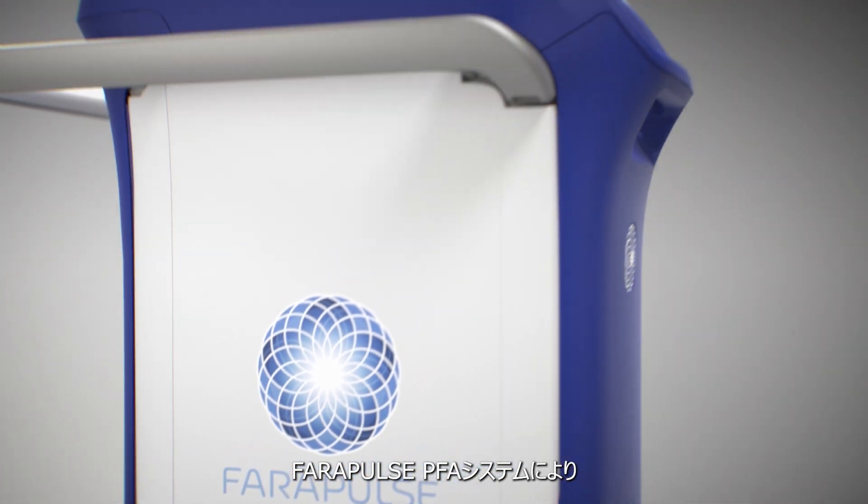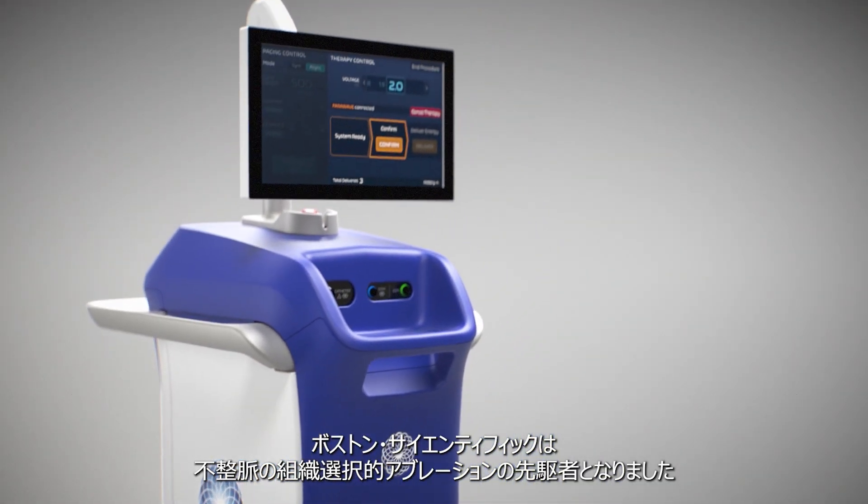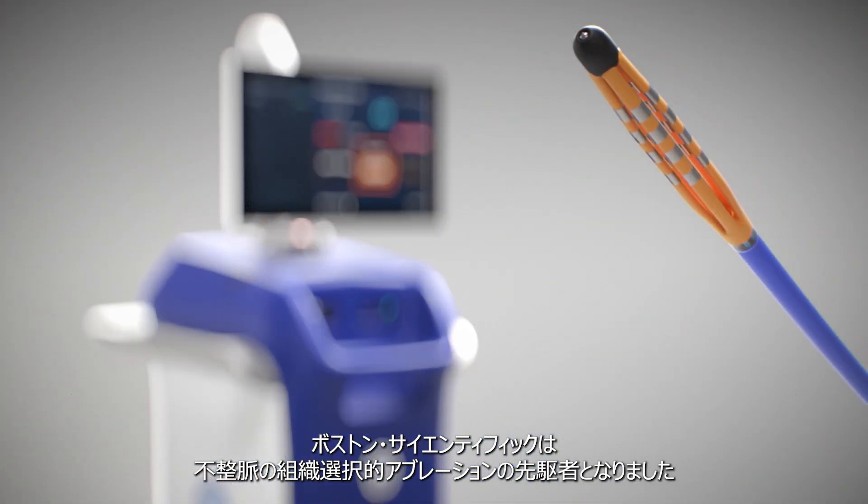With the Farapulse PFA system, Boston Scientific is pioneering tissue-selective ablation for cardiac arrhythmias.